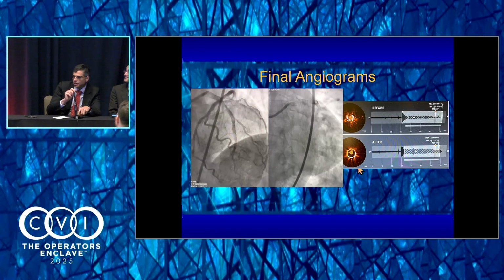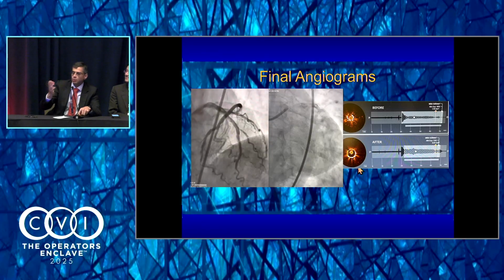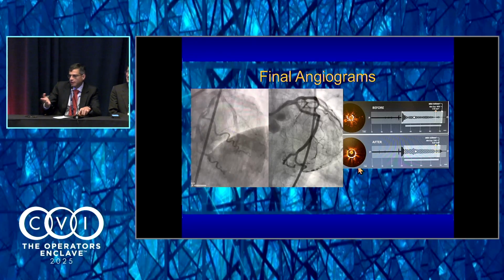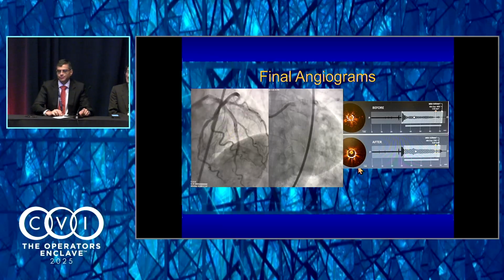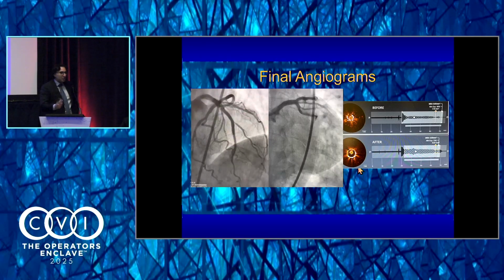Okay. I think that this vessel, middle LAD in a man, I mean, it's not going to be 2.5. Yeah, it's a woman, whatever. Yeah, but still, I mean, I do not see it being a 2.5 vessel. No, I see your point. So that being said, I agree with you.